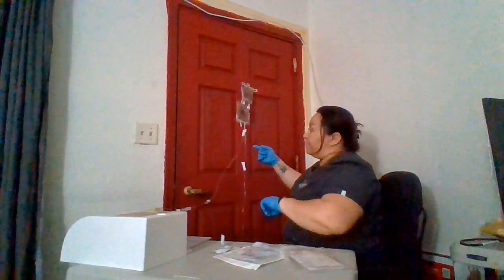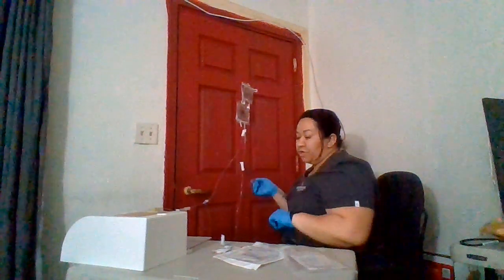Now the next step is we're gonna be counting for a full minute the drops. So this one has to be 100 drops per minute.